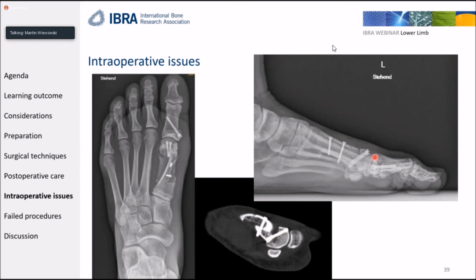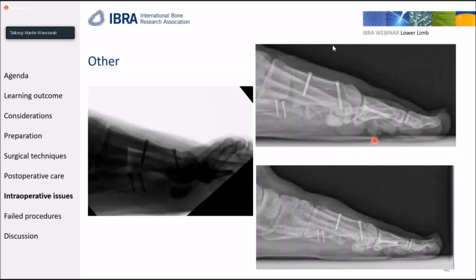But of course, you can see there's going to be a conflict here. So I will remove the screws after 6 months. I think it's mandatory to take the screws out in this case. I will do another CT to make sure it's fully healed. But the patient is doing okay. She's doing full weight bearing. I advise her not to do any sports activities until 6 months, until the fracture is healed. So this is something which can happen.